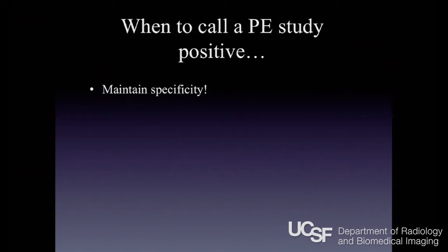Now, as I said, we don't necessarily agree on the cases of small PEs. And the worst thing that you want to do as a radiologist is overcall PE. We'll talk a little bit about the significance of small PEs in a second. A single small PE is probably not clinically significant. I'm a radiologist, so I'm going to throw in a 'probably' there, because that's what I do. So you want to maximize your detection of clinically significant PEs, but minimize your detection of clinically insignificant PEs, which are small.